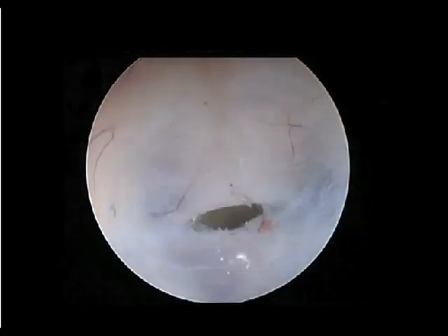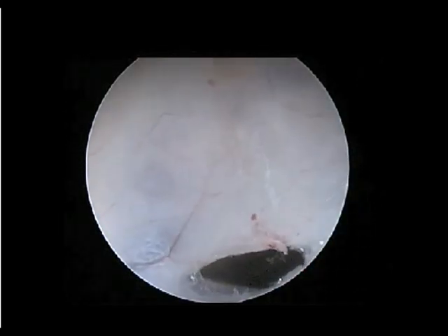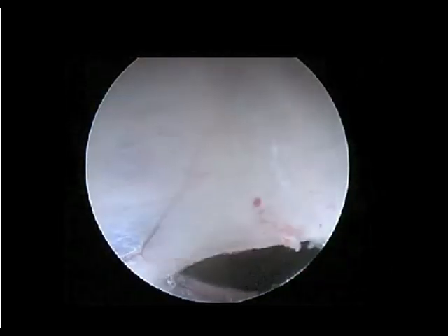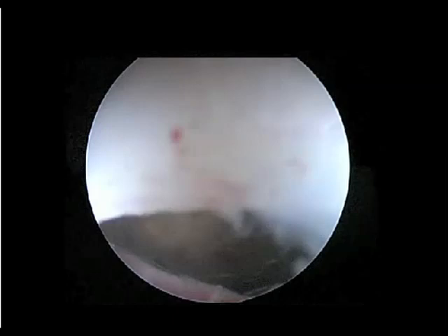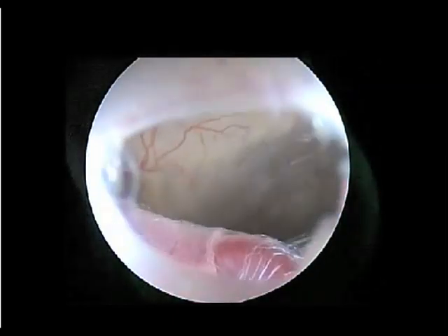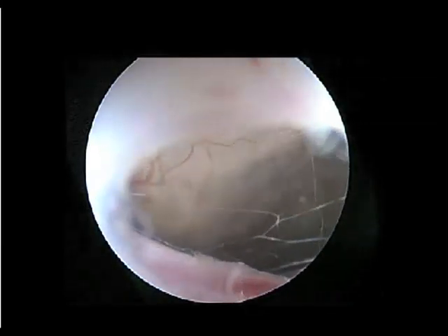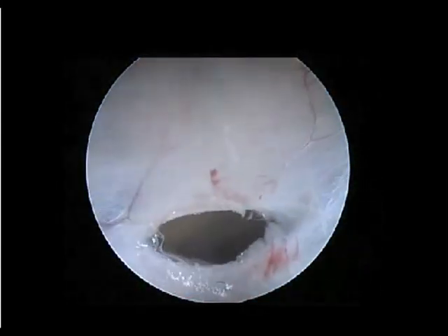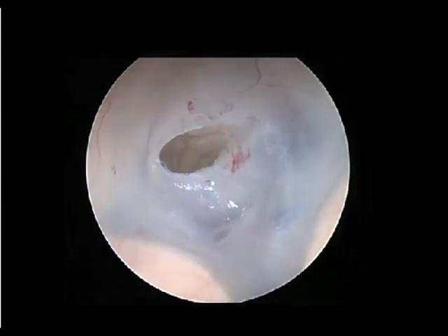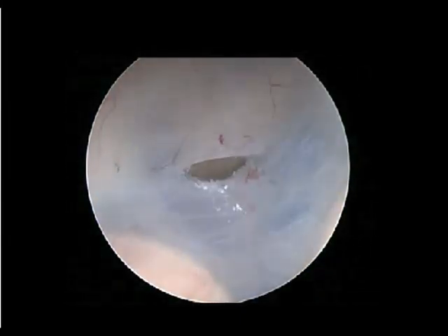Once the stoma is sufficiently large, the prepontine cistern is then inspected. The basilar artery is seen just inferior and posterior to the opening that we have just created. If significant arachnoid bands are seen, they can be dissected to further facilitate flow of CSF. We do not recommend aggressive exploration, however, given the risk of damaging arterial perforators of the brainstem.